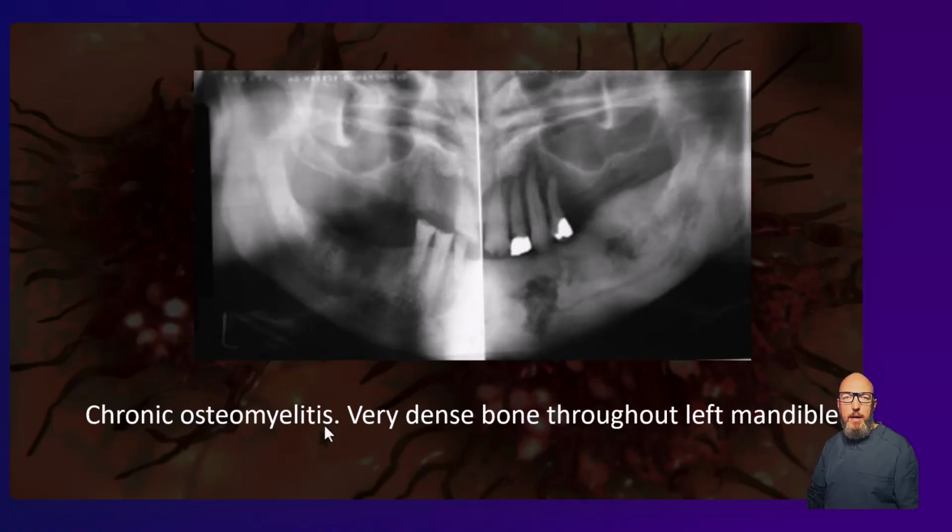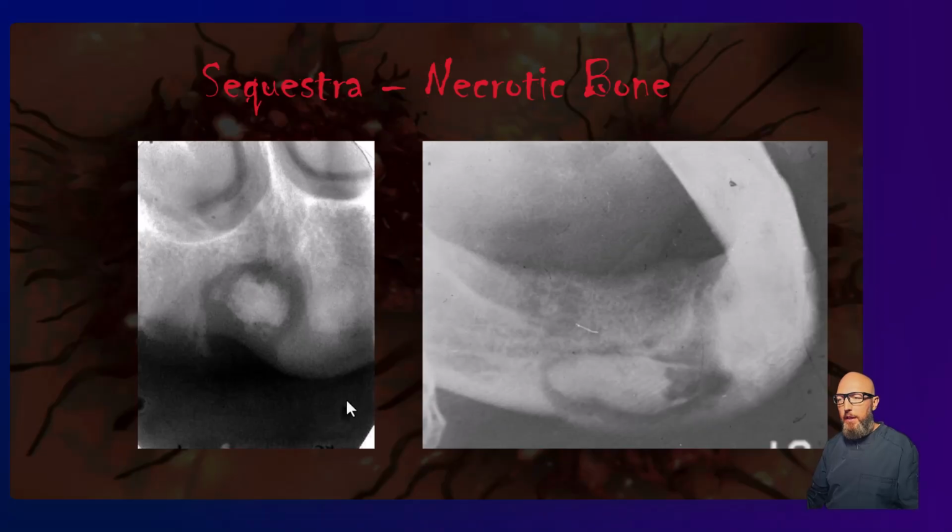Just like when we're talking about chronic periapical inflammation, sclerosing osteitis, it's when we see more of the chronic stage, that chronic reactive bone to the infection. And then this should make you think of what? The Hallmark channel, right? We have our Sequestra of osteomyelitis.